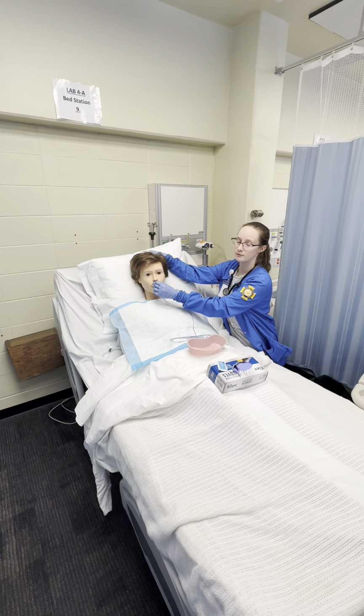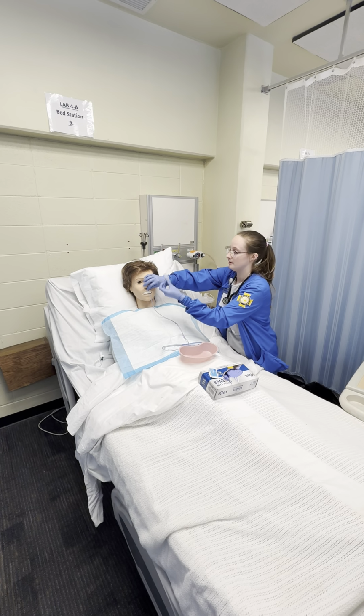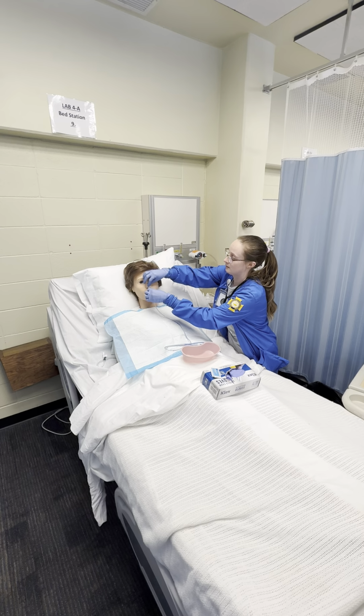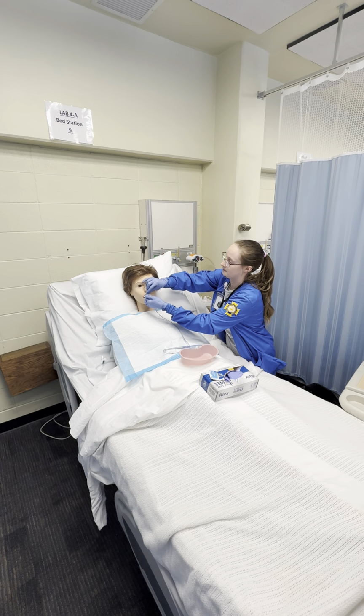For the video's sake, the tube would have gone to where the marker is, but we can't get the tube to go through the mannequin very well. But in this case, my patient is at the marker, so I would go ahead and loosely secure it. I would lean the head back, and then insert the tube, and every time that I go up, I'm going to tell them to swallow. So, you swallow for me.